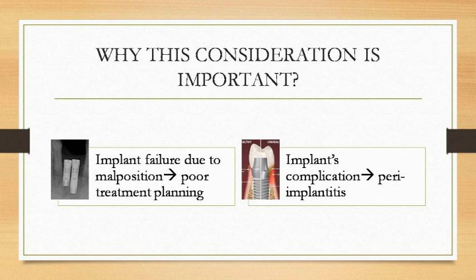There are also a few cases where the implant was placed out of the alignment of the alveolar ridge. These cases would certainly give a poor treatment outcome and lead to dissatisfaction for the patient, especially in the aesthetic area. Periimplantitis, which is the inflammation that occurs around the supporting tissues of the implant and involves the loss of alveolar bone, can also occur if no proper treatment is done.